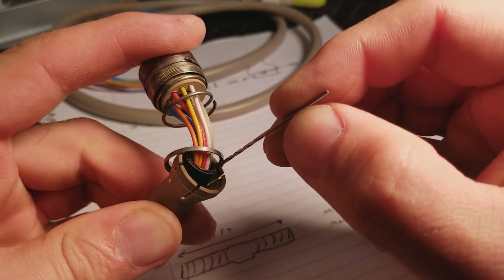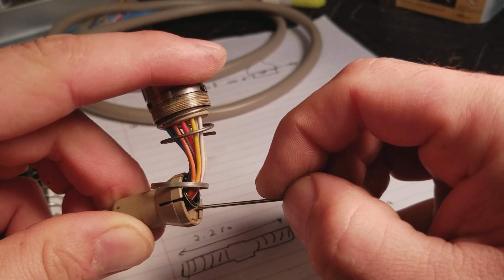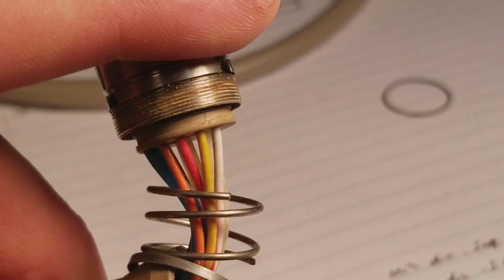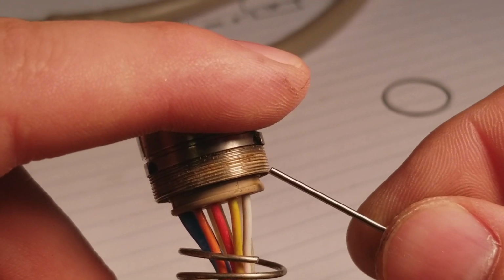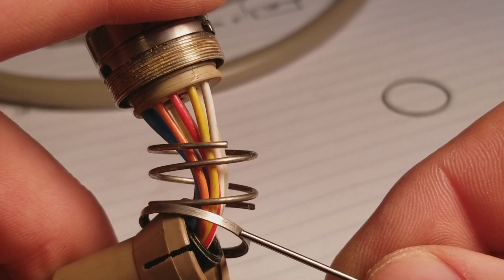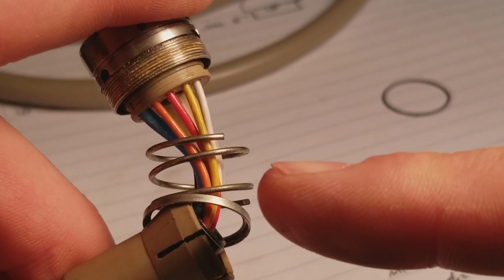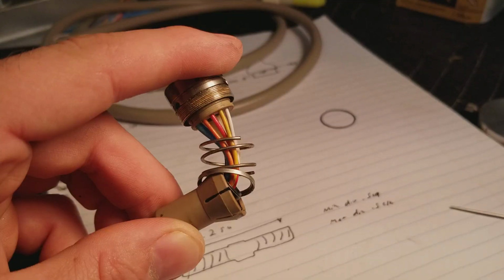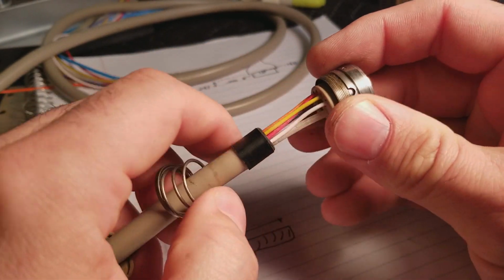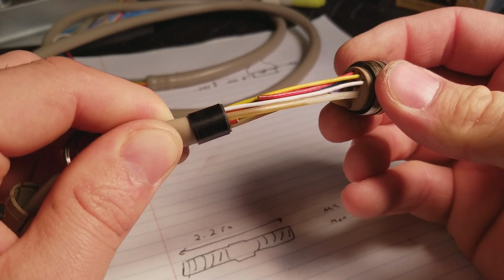See that little channel? This little channel that runs right in here, that's the piece that snaps around this right here. Let me zoom in again so you can see a little bit better. This is that little flange that engages this little channel. This metal ring goes over this whole piece to keep those fingers in, and this spring keeps it pushed down. All right, so you just pull this back and voila, now we have access to all the cables that are inside here.